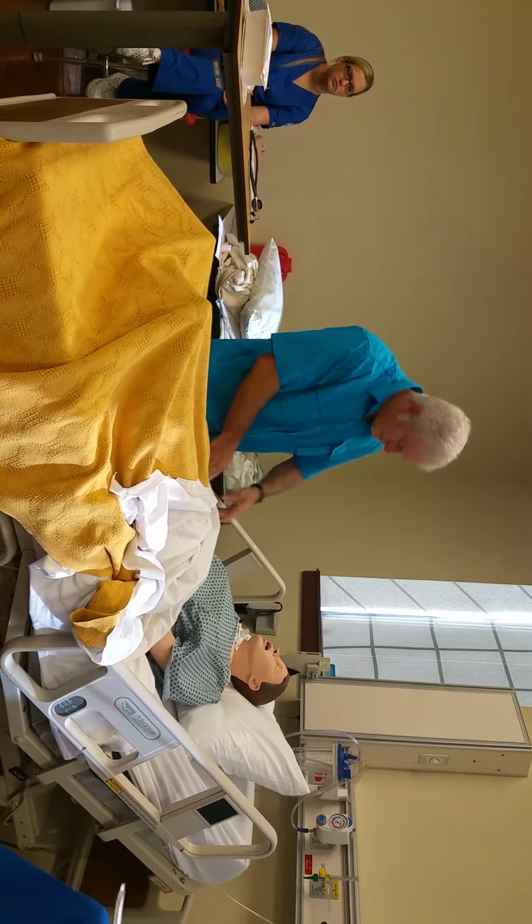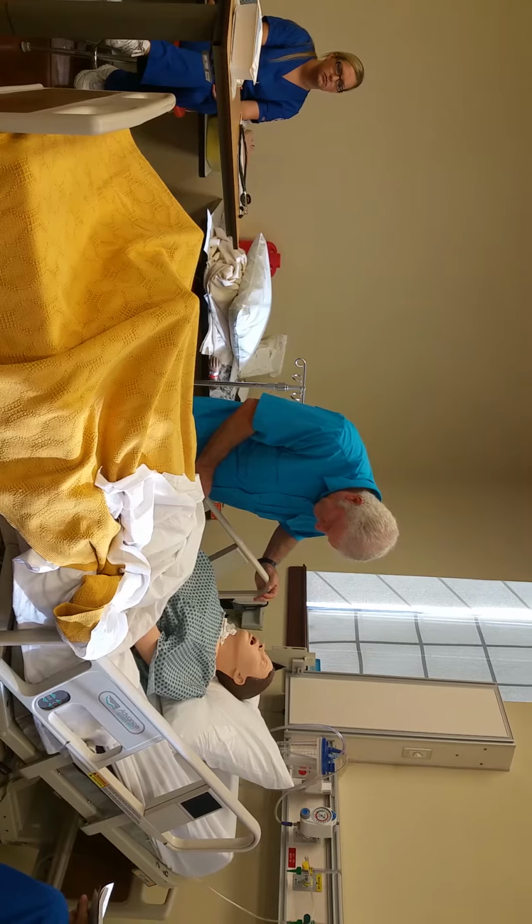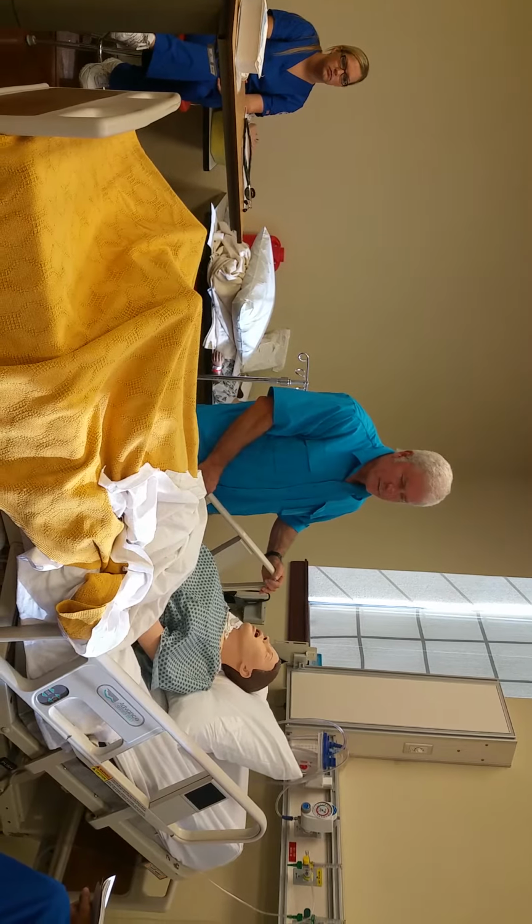Okay, now we're going to put your NG tube in, and I'm going to do this by myself, and I'll show, because I'm going to make you guys do it by yourself, no tech help.